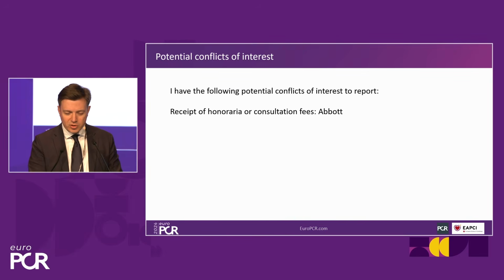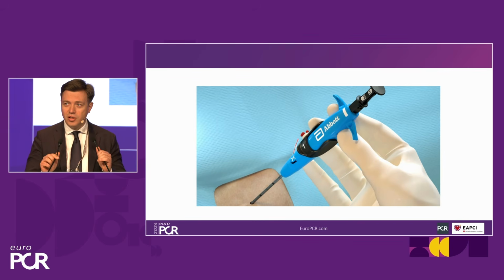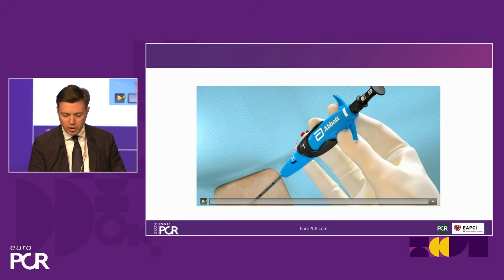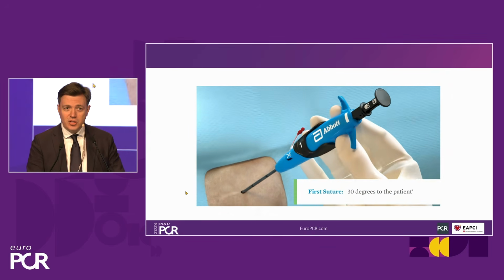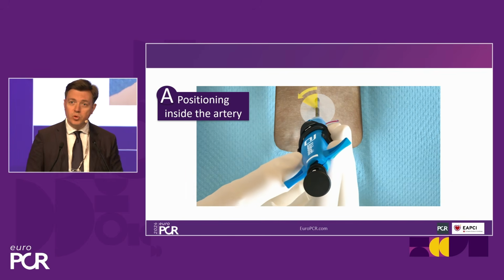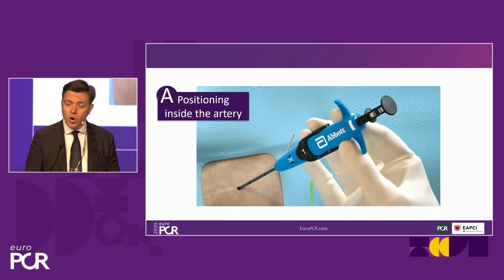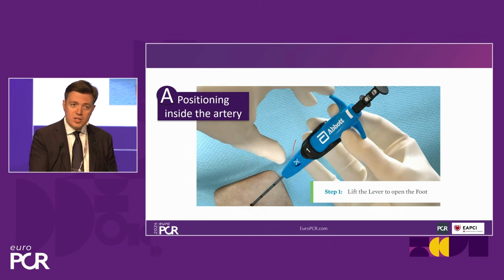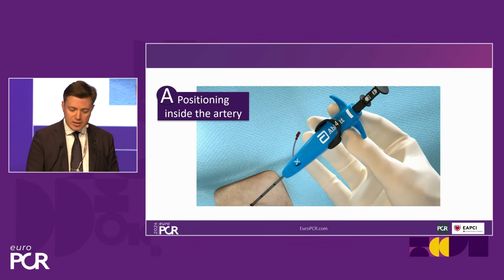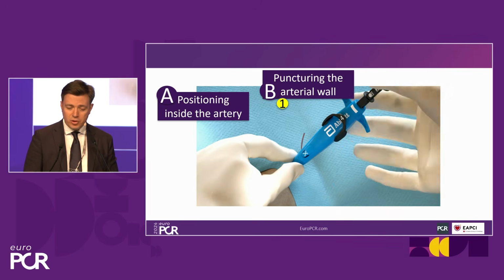One of the important points when starting to use it, of course, is to know the steps of how to perform suture-mediated vessel closure. Of course, you can go to YouTube and see videos with these steps, and it's important to keep an overview of them. The first is positioning the device inside the artery, and we are going to talk about this a lot, what is important in that respect. Second is to deploy it correctly, and you saw the first step of deploying it with the plunger.